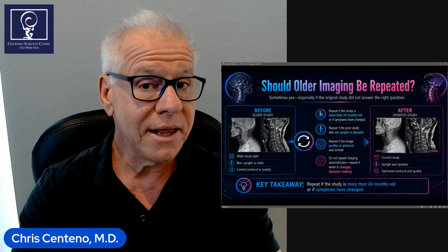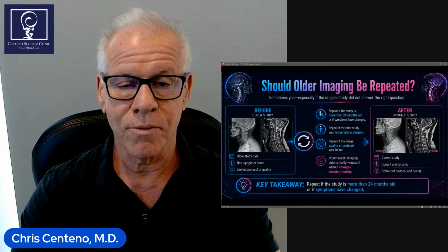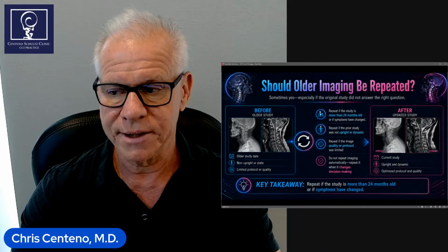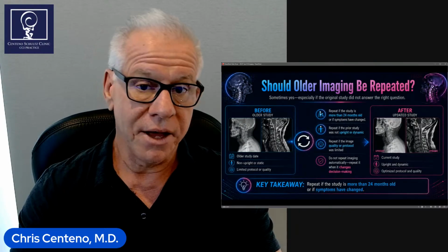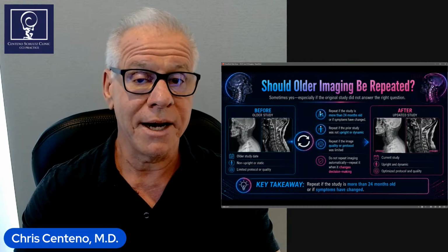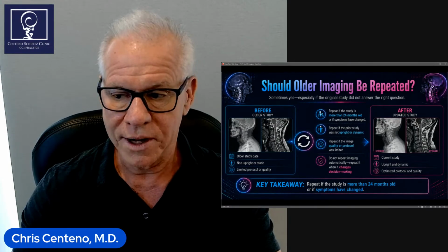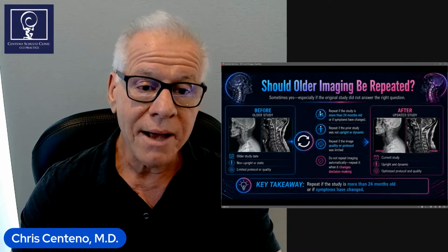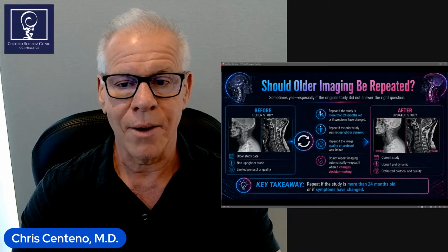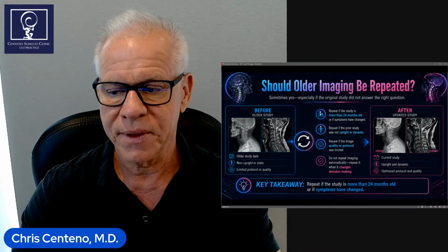Now, if it's done last year and there's been some dramatic change in your symptoms, we want to make sure there's nothing new, then we will repeat it. And again, another thing that we often repeat on the MRI front is if it's not a dynamic or movement-based study. So if so, we've got to get one. And sometimes there are quality issues on the MRI. So that would be another reason why we might want to repeat the image.